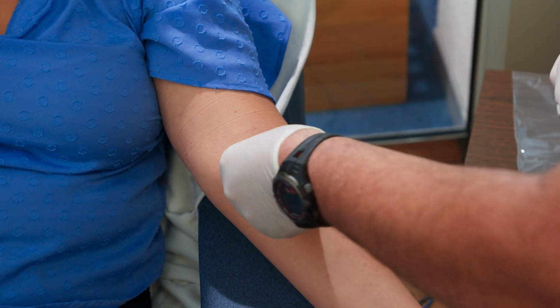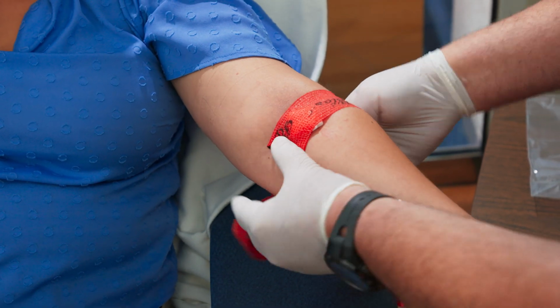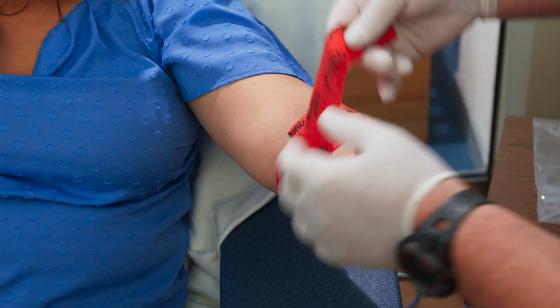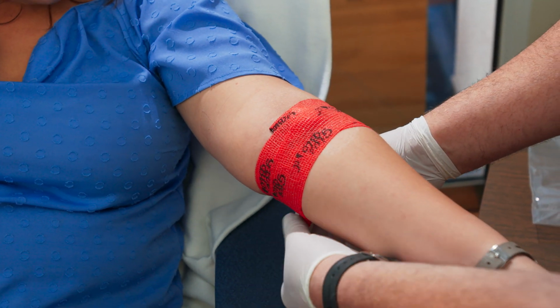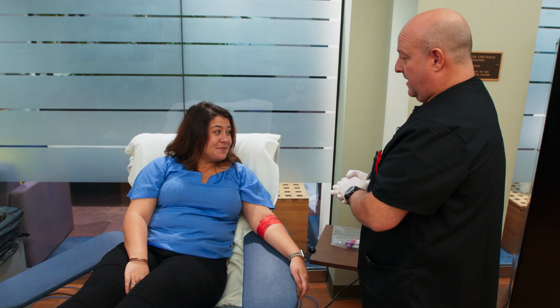You've stopped. Make sure you leave this wrap on your arm for at least the next hour. Okay. No heavy lifting for several hours. Make sure you keep hydrated and make sure you don't skip any meals. All right. Would you like anything to drink while you sit in the chair? I would love some apple juice. Excellent. I'll be right back.